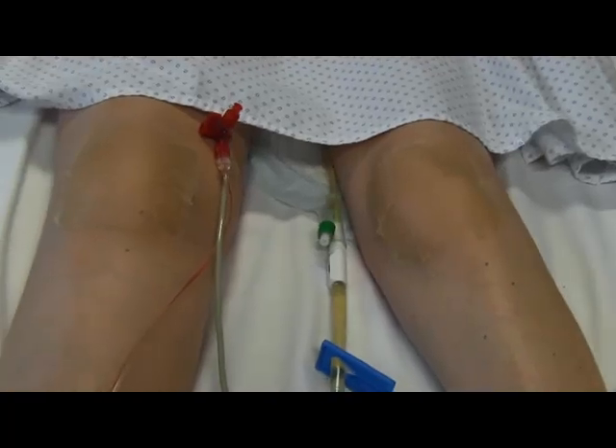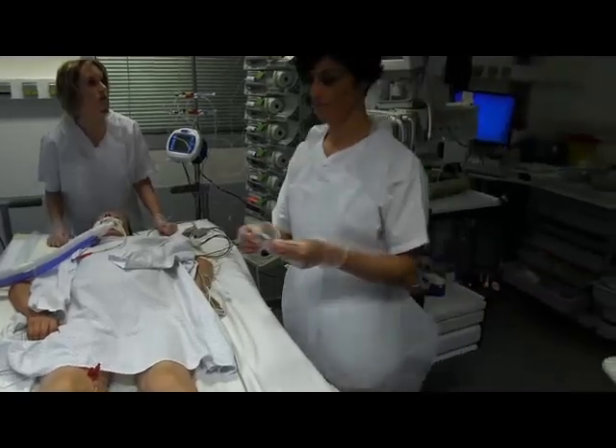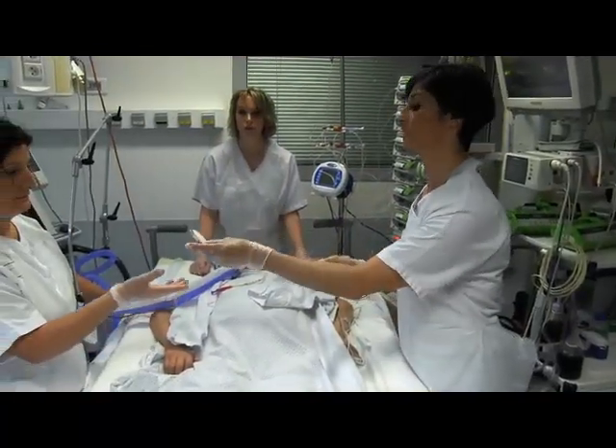Protect the skin on the forehead, knees, iliac crests, and thorax from pressure sores using adhesive pads. Protect the patient's eyes and get the electrocardiogram electrodes ready for use.